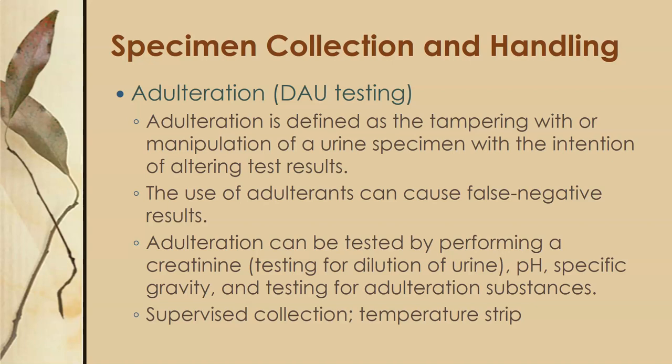A little bit on adulteration for drugs of abuse testing. Adulteration is defined as tampering with or manipulation of a urine specimen with the intention of altering the test results. The use of adulterants can cause false negative results. Adulteration can be tested by performing a creatinine test — testing for dilution of the urine — a pH, a specific gravity, and testing for some of the adulteration substances. Ways around that include a supervised collection where you witness the person providing the sample, and a temperature strip to make sure the urine is at body temperature.